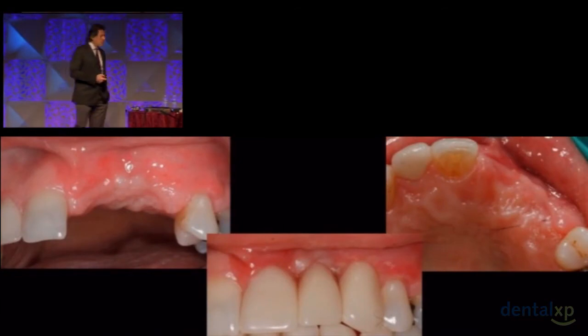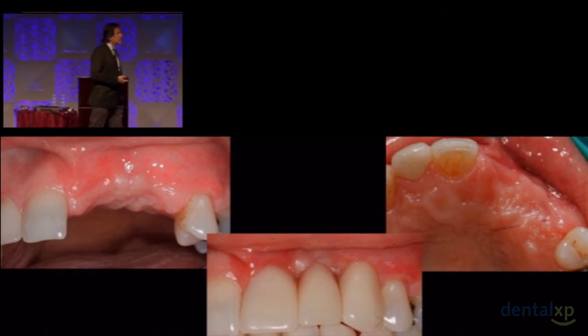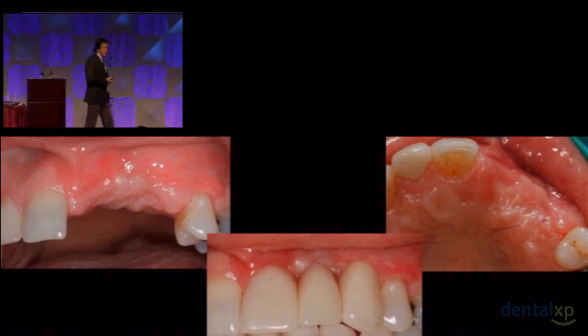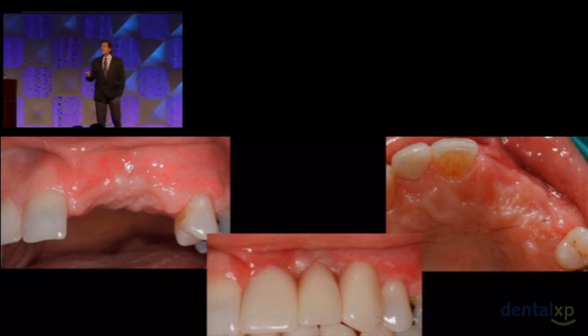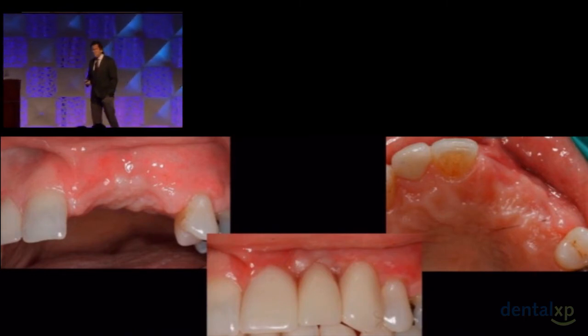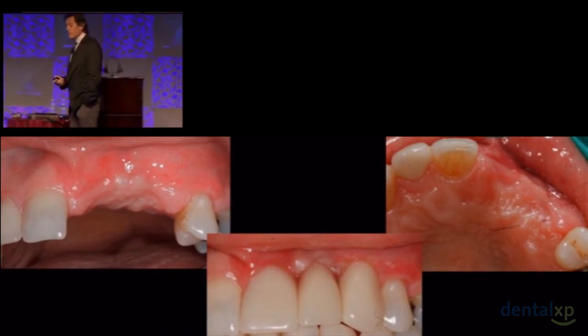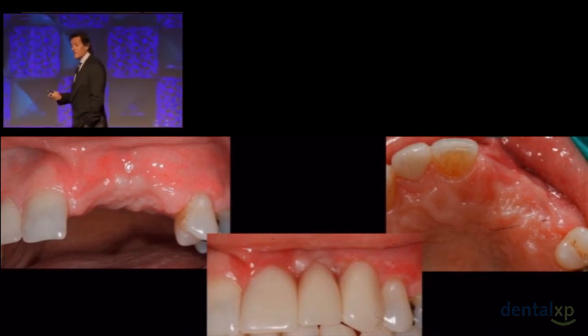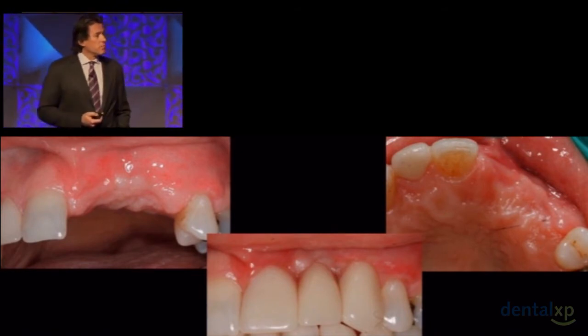This patient lives up in Connecticut. I get a picture from her dentist. General dentist actually went to dental school with me at University of Pennsylvania, and I received these photographs just recently. And he said, Maurice, you know, I don't really know what she looked like when she started, but I just made her a flipper appliance. It's 4 months out. I'm going to take a CT. When do you want to place the implants?